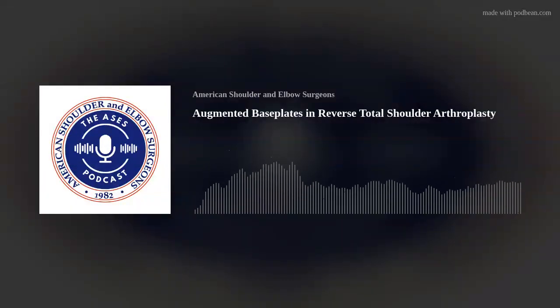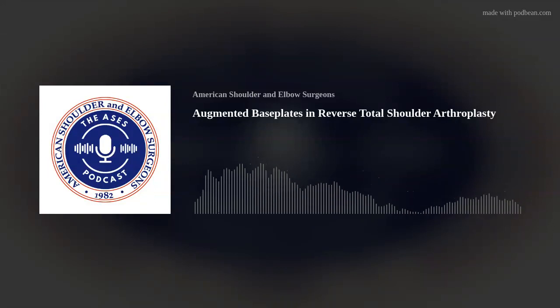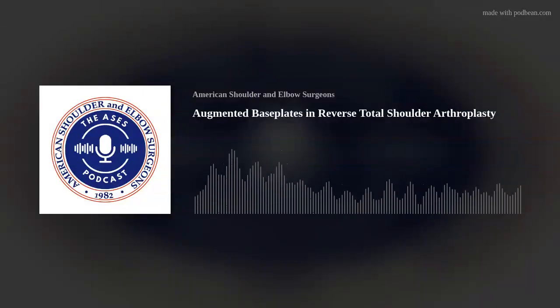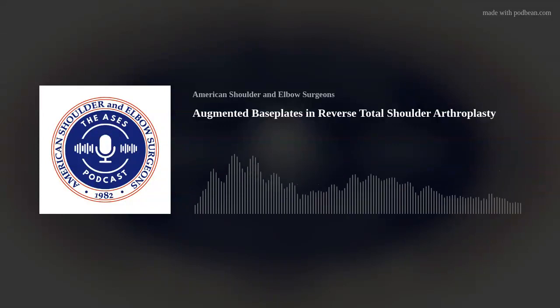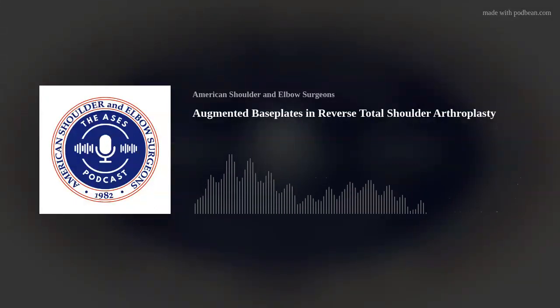And we actually found that patient, Brian, that you're just describing, did somewhat better with the augments. We found that surgery time was better, PROs were better, range of motion wasn't any different, complications weren't any different, and the people who use this system were able to plan more reliably with an augment, not in superior tilt, than the ones that use a standard base plate. So after doing that study, taking less bone, shorter surgery time, more accurate planning, I've switched most of my practice to an augment.